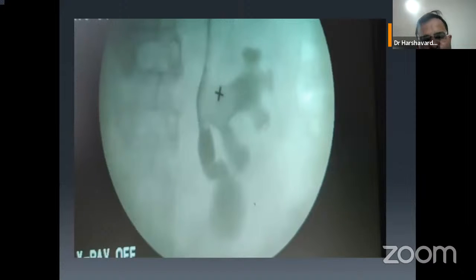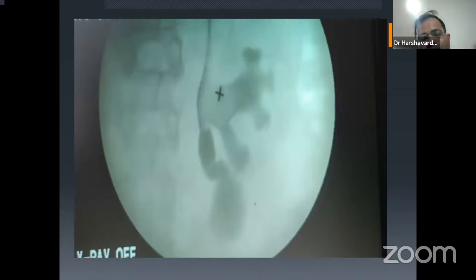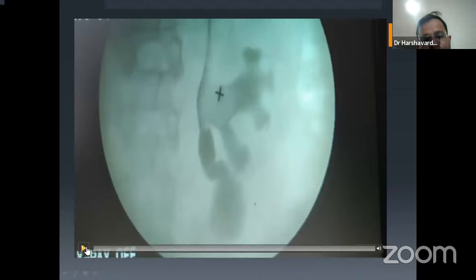It won't change its position whether the image is upside down or not in a correct orientation. So we planned to take a puncture in the middle calyx in a monoplanar technique, because other techniques could not have been used as the orientation was not in a proper way.